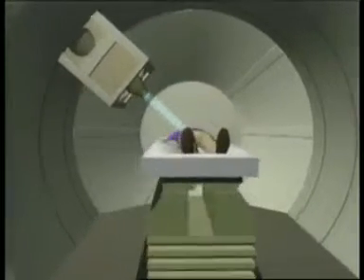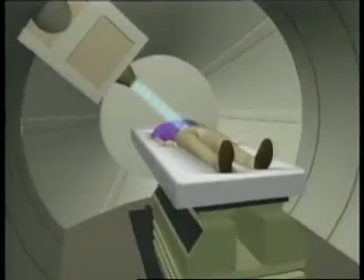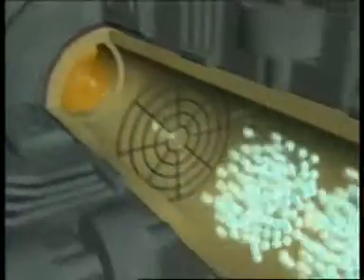The gantry revolves 360 degrees around the patient so the beam can be delivered at any angle. Each treatment room also houses a guidance system that monitors the beam delivery as it delivers the prescribed dose.